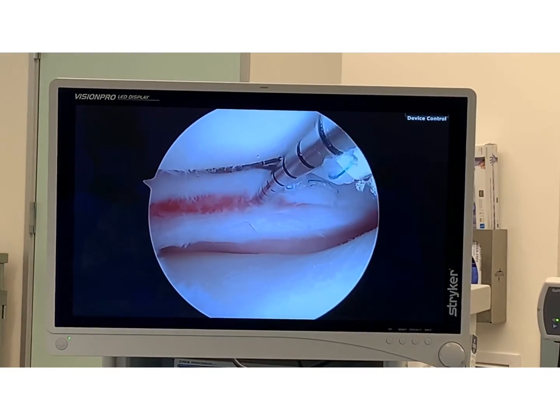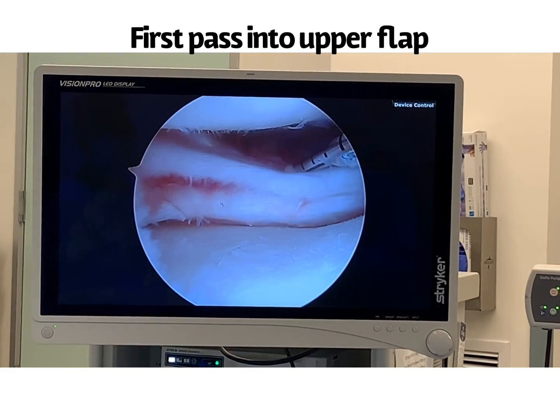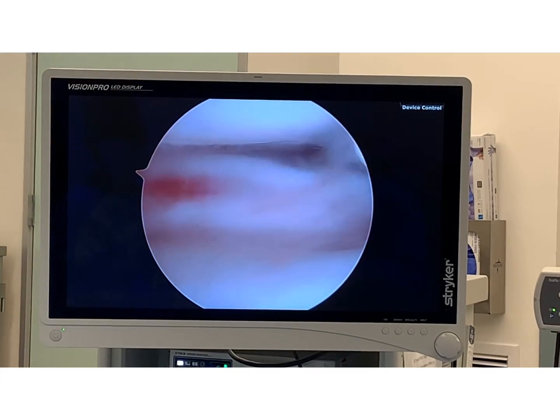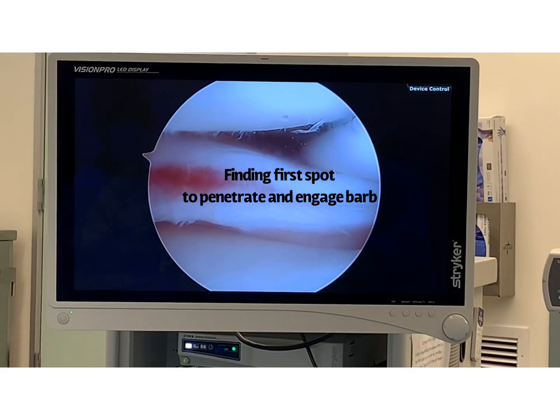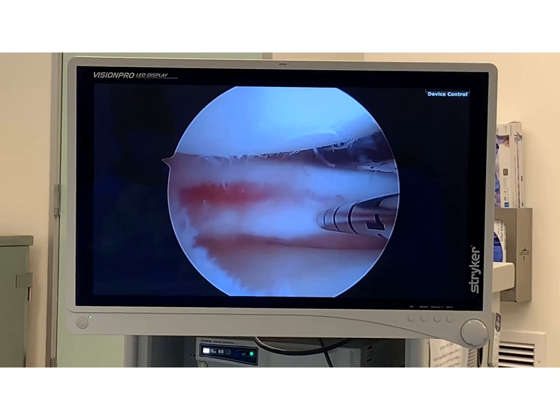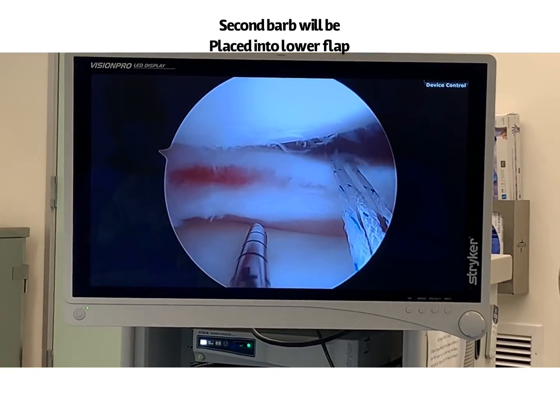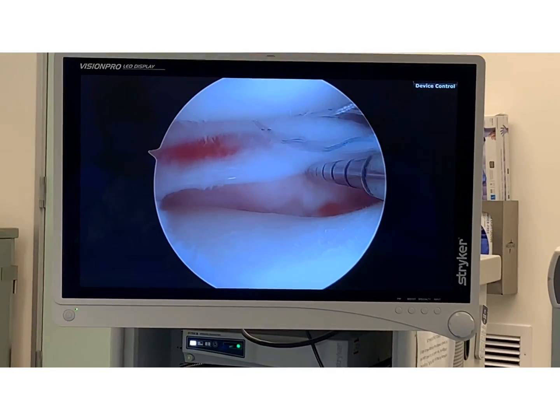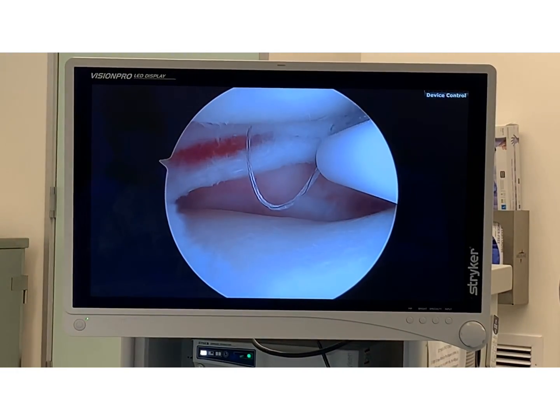Stuart is going to hold the scope for me. I'm going to put it right over here. I've got to stay away from that structure over there, so I'm going to go over here. I'm going to position away from the neurovascular bundle right there. There's the first suture in there and it's locked in with a barb. Now I'm going to go under right over here, about the same spot. I don't want to go too deep — I don't want to damage any neurovascular structures.